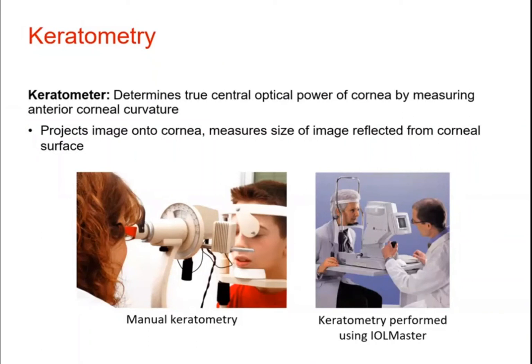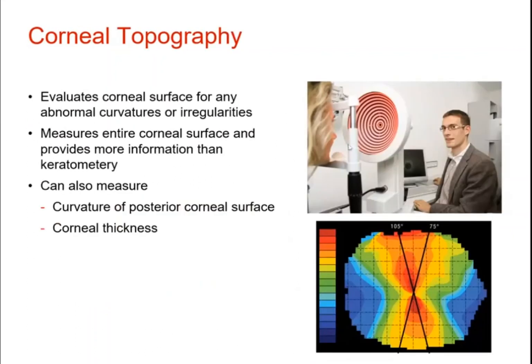So what I have understood is, when it comes to keratometry, auto or manual, they measure the center, but corneal topography measures the peripheral part and extrapolates the reading for the center. Is it right? Yeah, that's right. All right. Thank you very much. Thank you.